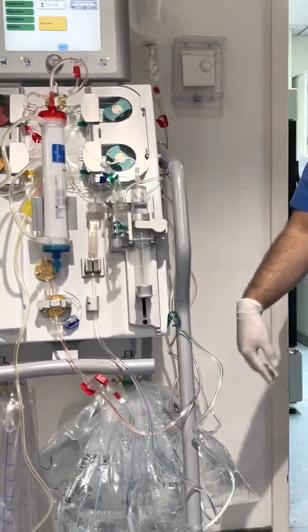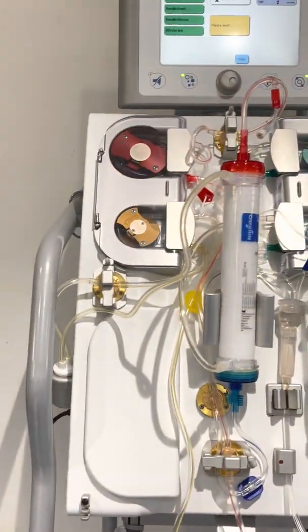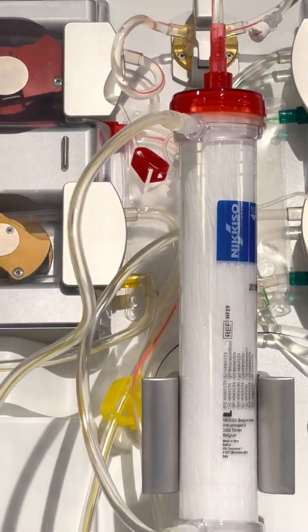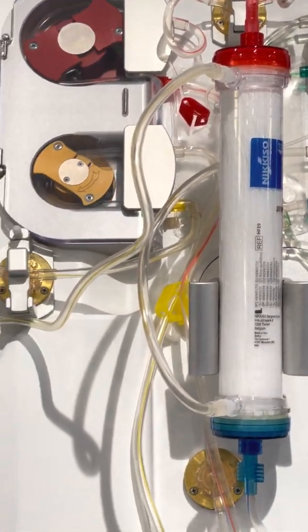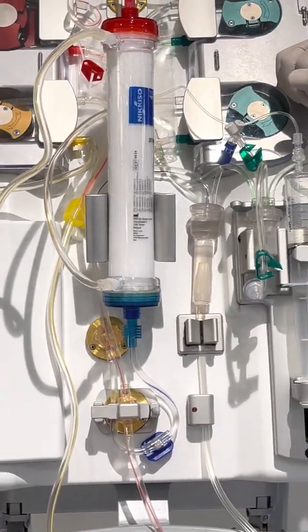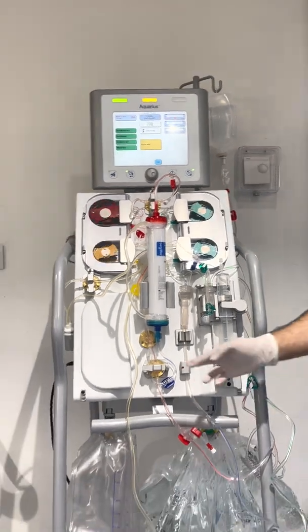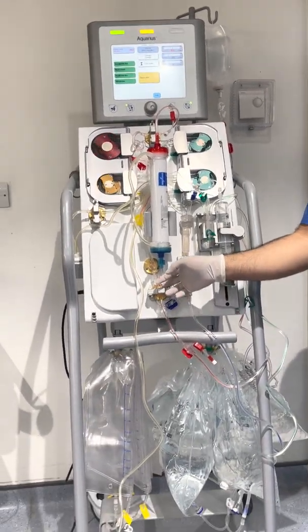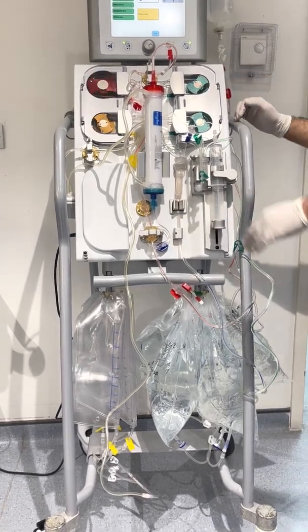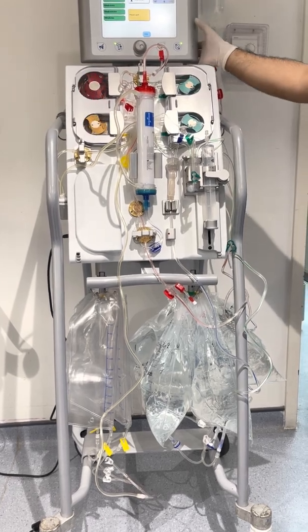If it moves, small... we're advising, if there's a small clot, to return all the blood and change all the circuits, because it happens sometimes for us. This one exploded, really. I think we experienced that one. So we're just advising, if you see some clots from here and it shows venous pressure high.